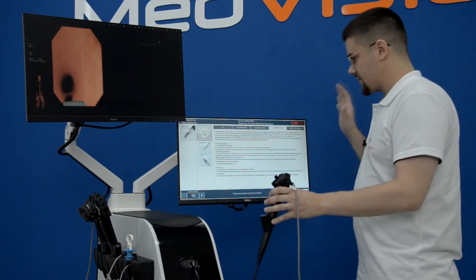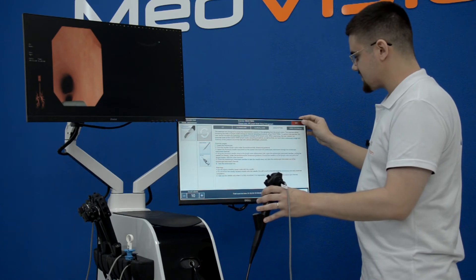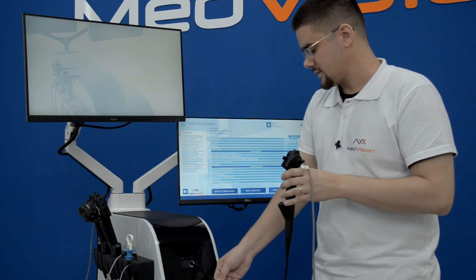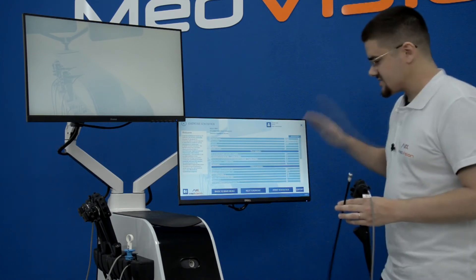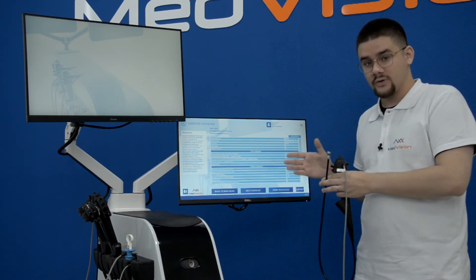I will now close and exit the module by pressing Exit in the top right-hand corner, then remove the instrument gently. Just like with all of our surgical simulators, you get a detailed report in the same format — they are always the same.